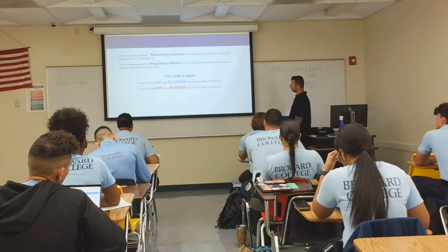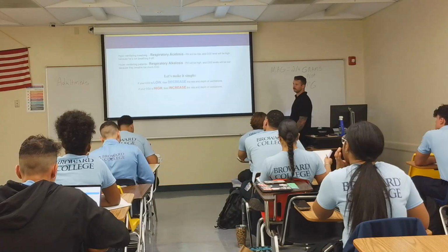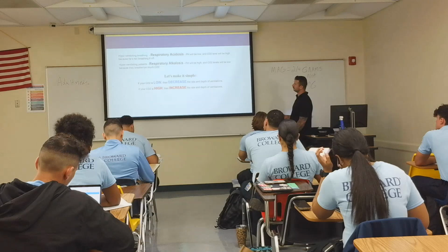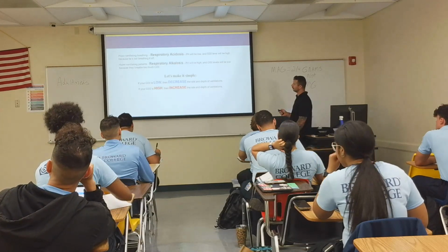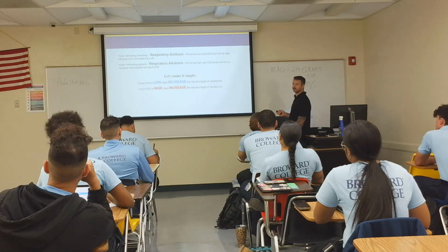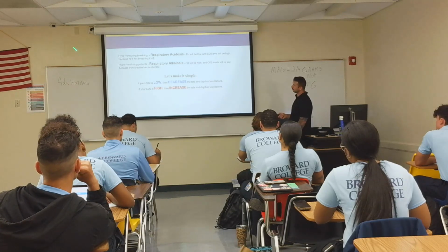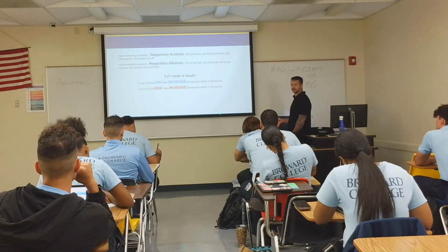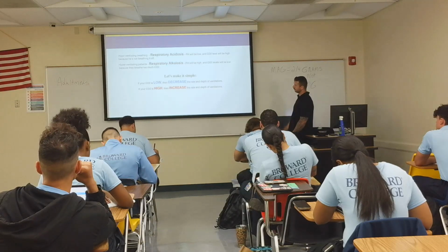So let's make it simple. Hypoventilating is what? I'm breathing how? Slow, right? So hypo, respiratory acidosis. My pH is low, my CO2 number on the life pack is gonna be high. So if I have 50 on my life pack, am I acidic or alkaline? Acidic, right? I'm breathing slow, my pH is going down, so my life pack number is gonna be up, right?